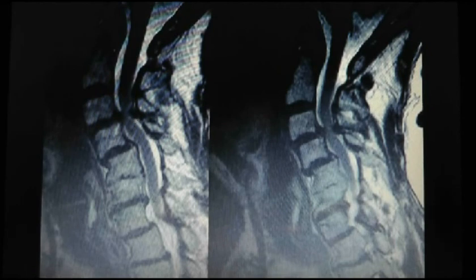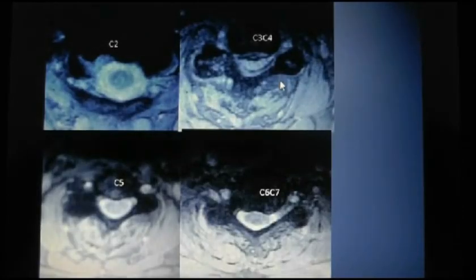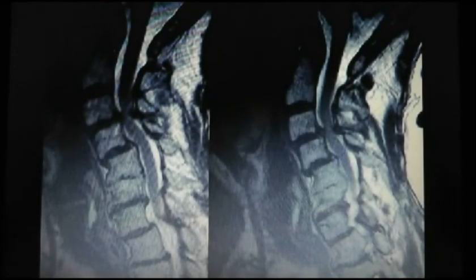It's real ligamentum flavum there from the lamina, but it isn't a big bulge into the spinal canal. It's not as big as you would expect to see on the axial cut, is what you're saying. Yeah. But for me, it's a concern. I wondered if this is a posterior problem. Well, it always matters when you measure the anterior-posterior dimension of the spinal canal. It is narrow. So that's at 3-4.